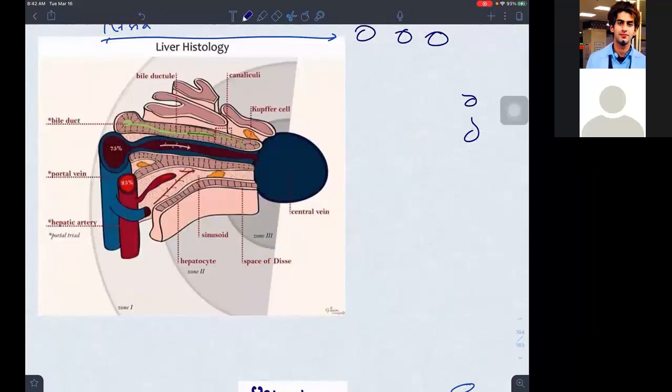Can we see the bile duct opening its canaliculi? Isn't it? Can we see the macrophages also, the Kupffer cells? Kupffer cells is also there. So this is the portal triad which we have, which we should first have the concept.